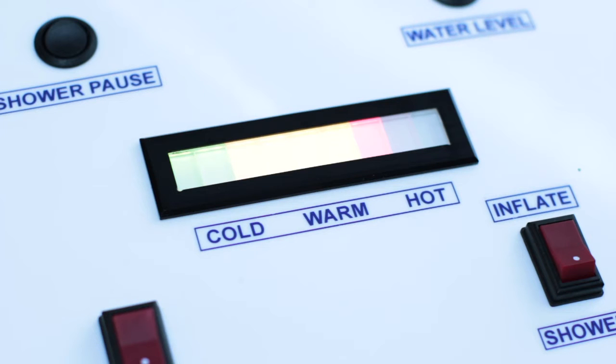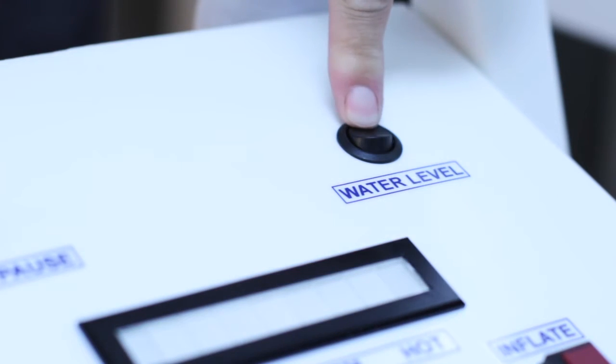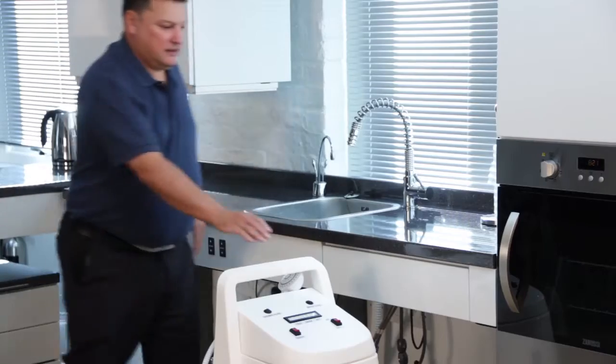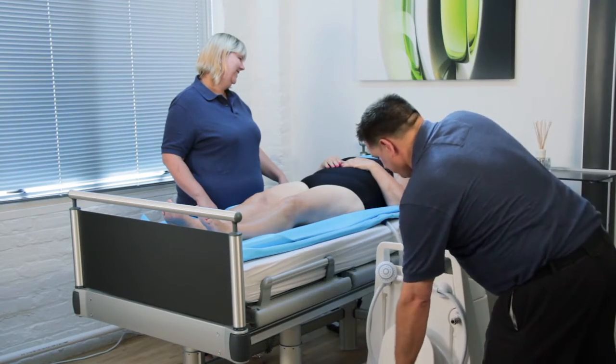Once the tank is full, the beeping will change to a constant note. Turn off the water taps. Press the water level button to turn off the bleeper. Disconnect the tap hose. Unplug the mains plug. Wheel the Watergenie to the patient's bedside and plug into a plug socket near the bed.